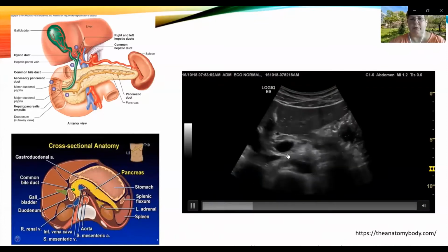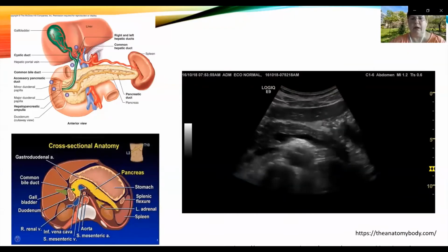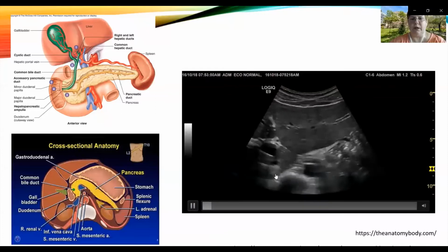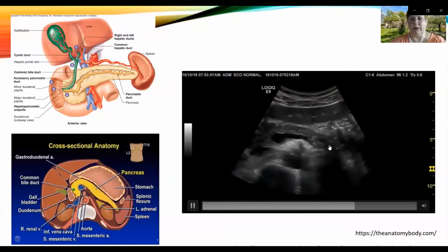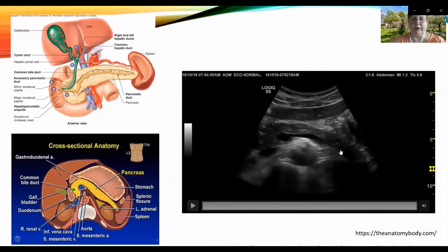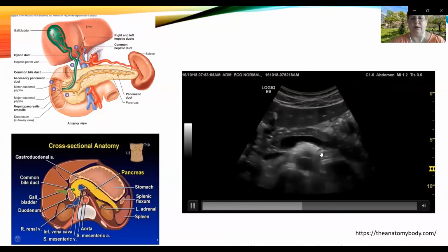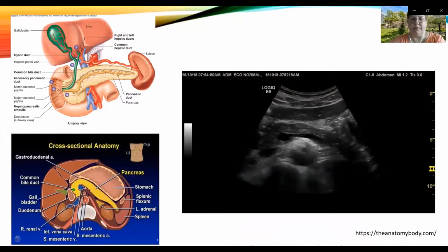Of course, the organ is a little bit more difficult to see as compared to the liver because it's a retroperitoneal organ, so it's far away. You need a little bit of skill to find the structure, but by using progressive compression, usually you are not going to have any problem in evaluating the whole organ. It is very important whenever we talk about ultrasound to evaluate the organ completely in order to avoid missing pathology that is in areas that you have not seen when you have made the evaluation of the structure. So just a little bit to remember the anatomical features of the gland.